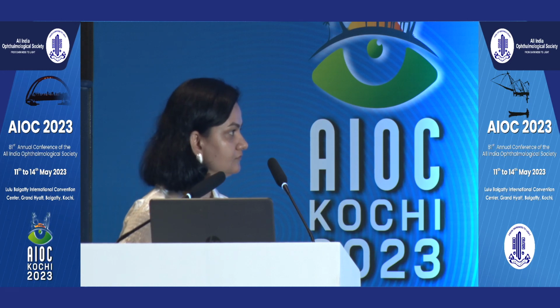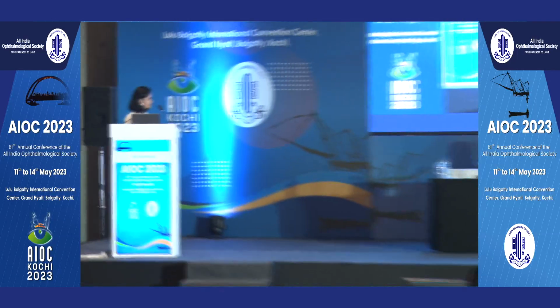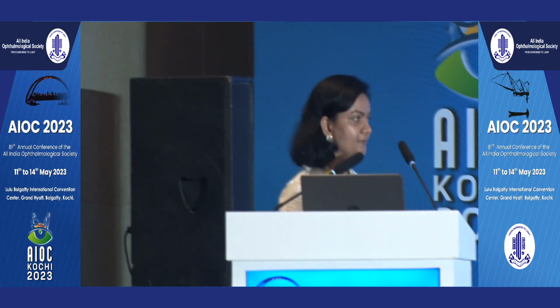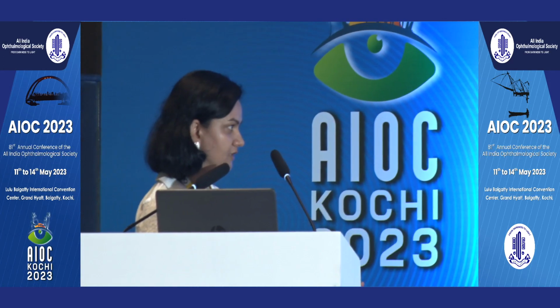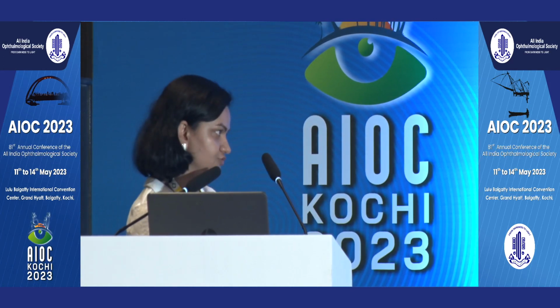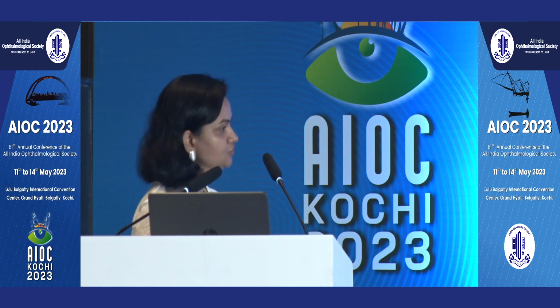So you put the limbal pieces just on the cornea with the glue, and then you put one amniotic membrane. What was the orientation of the amniotic membrane? Epithelial side up or epithelial side down? Epithelial side up only, ma'am. Why did you say it's sandwich? No, ma'am, it is not sandwich, but a sandwich technique was tried in which first they put the AMG over the cornea, then the limbal pieces, and then another AMG. But we cannot use that in our clientele because AMG costs a lot, and our clientele is very poor. So that is why the surgeon thought of maybe using only 1 AMG.